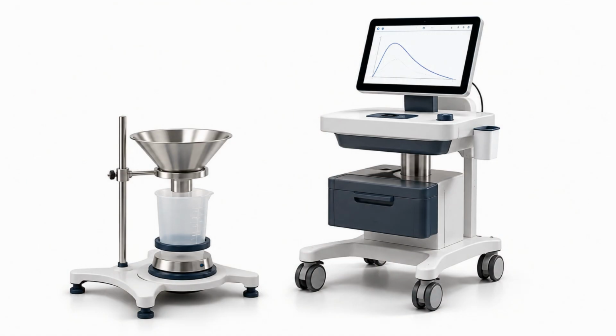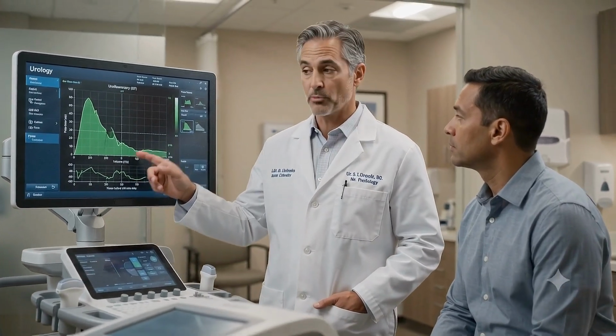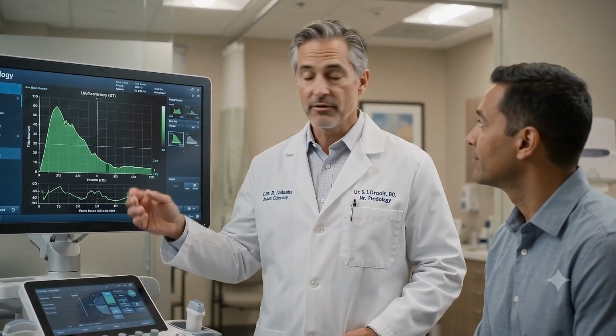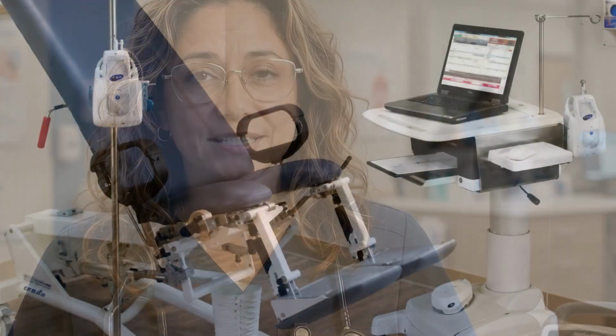The patient urinates into a specialized collection device connected to a computer. The uroflowmetry results show how well urine flows from the bladder. We evaluate the flow pattern, flow rate, and total volume to determine whether there's any obstruction or difficulty emptying the bladder. After uroflowmetry, some patients may need a quick bladder scan. Most can resume normal activities immediately. Encourage hydration, and follow up as instructed.